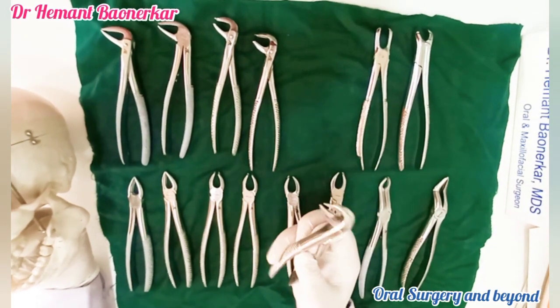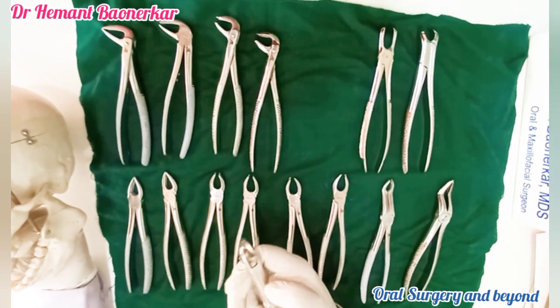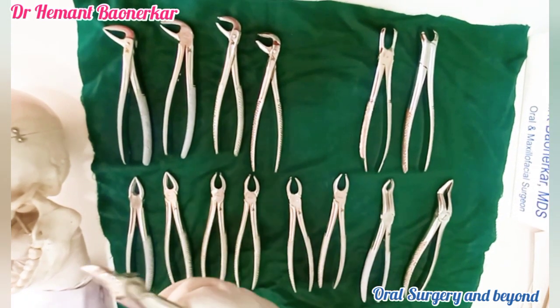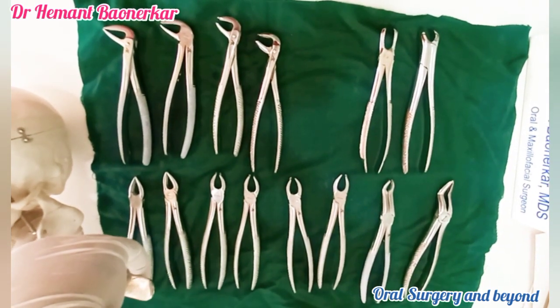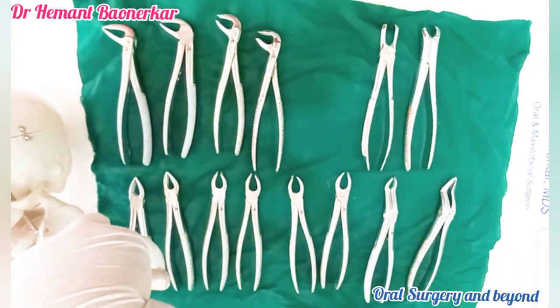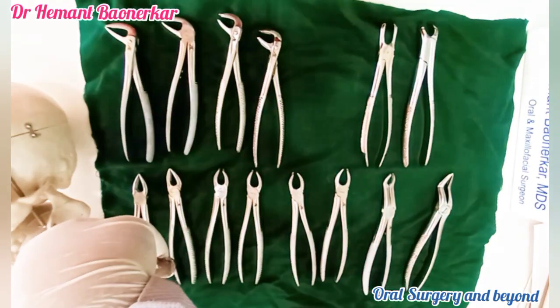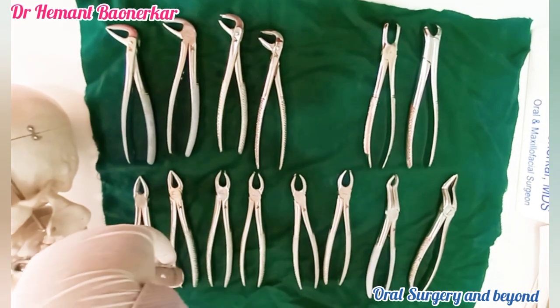This is a mandibular cow horn forceps. The two beaks are shaped like cow horns. We can use this for the deep roots of the mandibular molar. The forceps engages at the furcation of the tooth and holds at the furcation level, and we can take out the tooth with the extraction forceps.